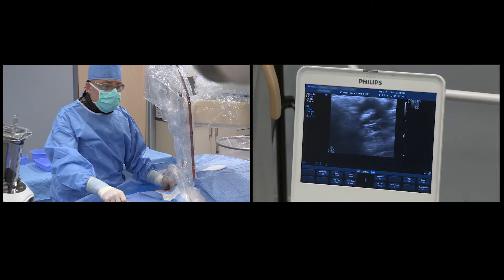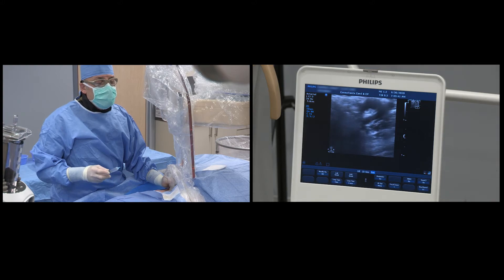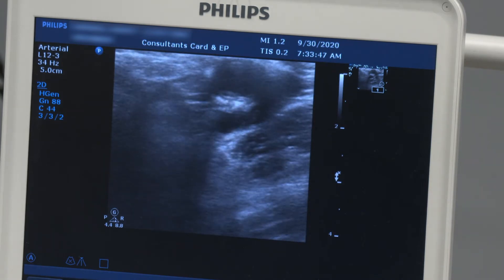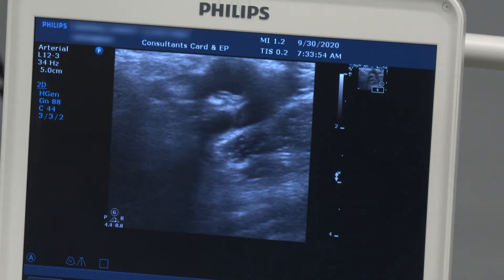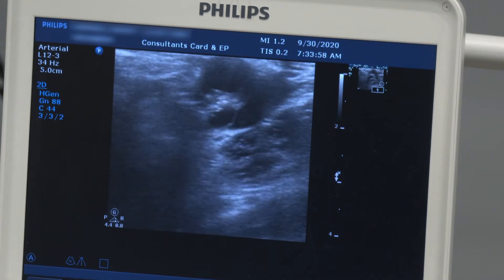The advantage of ultrasound guidance is that you identify the diseased area of the artery. Here you can tell that the posterior wall of the common femoral artery is highly echogenic — quite white in color — which is indicative of calcium deposition, while the anterior wall seems to be free.